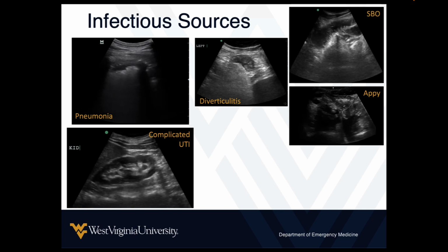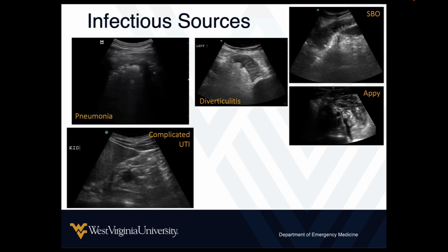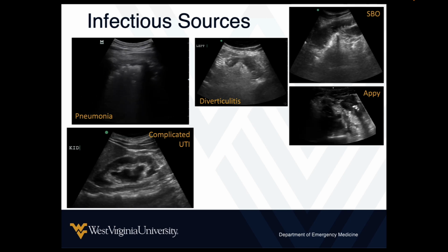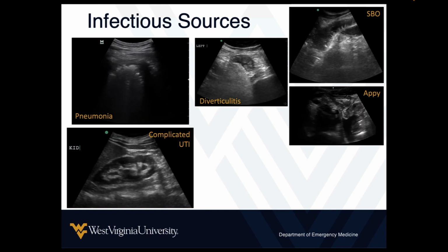And I'm not going to suggest that you're not going to CAT scan this person, you probably are, but when you walk out of the room and you say, this looks intra-abdominal, we're going to start appropriate antibiotics to cover an intra-abdominal source, and our differential is shortened. This is a very helpful scenario.